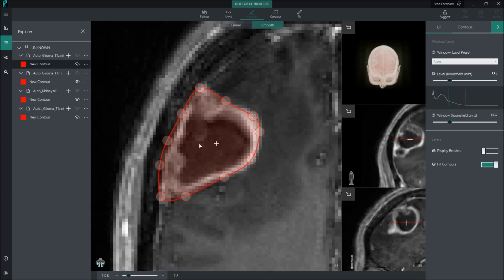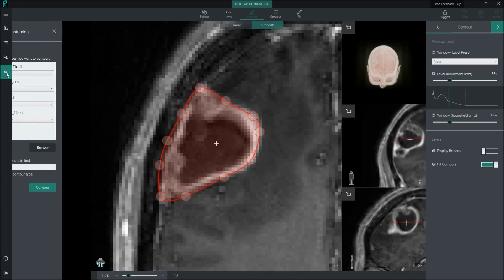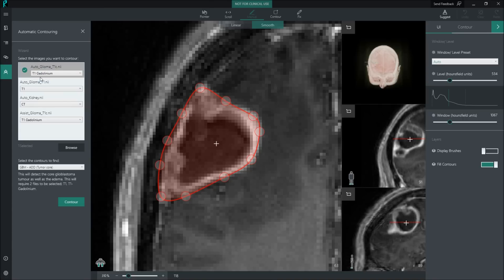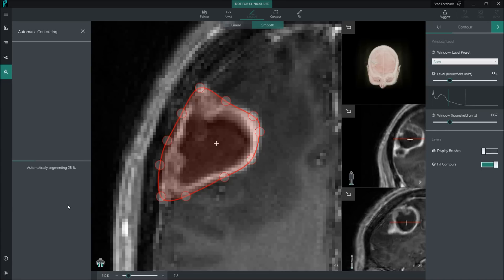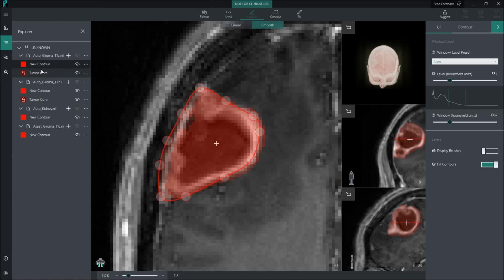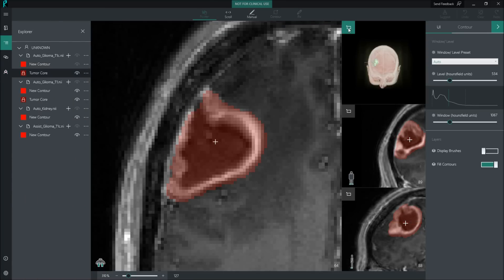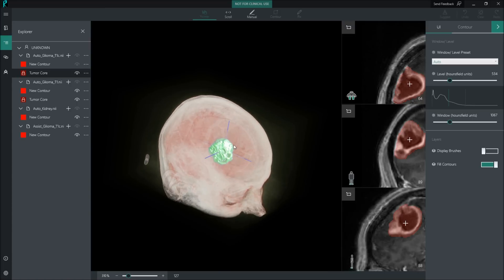Our AI algorithms can help here by doing the whole 3D segmentation completely automatically. In this tool, I'm selecting the patient images and then choosing a machine learning algorithm that has been pre-trained to recognise and segment this type of tumour on many similar images of past patients. The machine learning model we use here is a decision forest, which classifies each voxel in the image as belonging to the tumour or to the healthy tissue. Here is the automatically obtained three-dimensional segmentation.